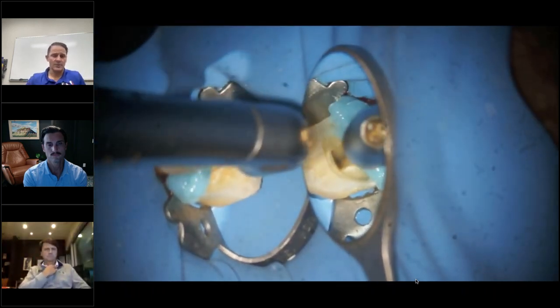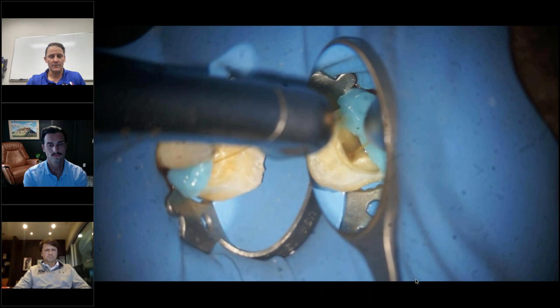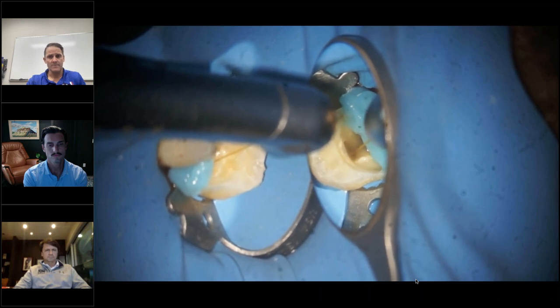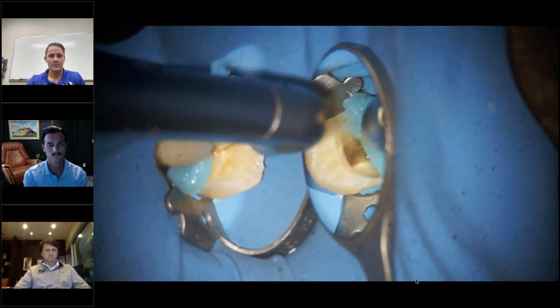Then we're coming in with our laser here, and with solutions in the tooth, we're activating, and then we're holding at the orifice level. We're in the distal canal here. Going back down, let off the gas, and then activate on the way out.